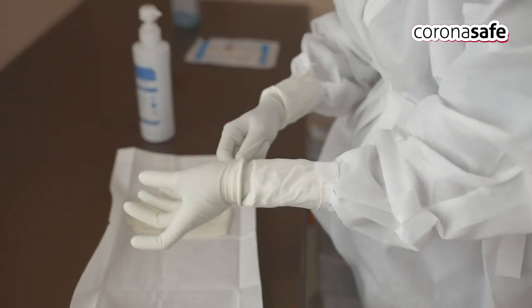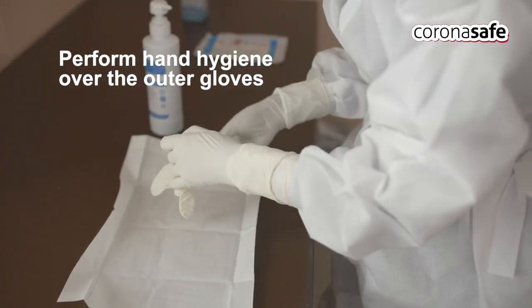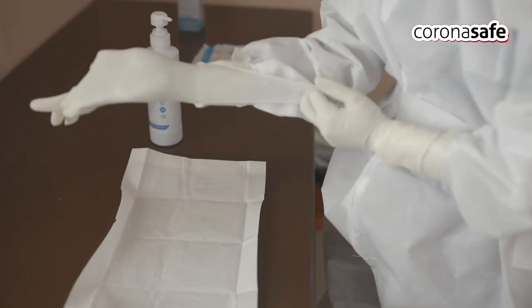Wear the next pair of gloves with which you are going to touch the patient and patient surroundings. A minimum of two pairs of gloves are mandatory.